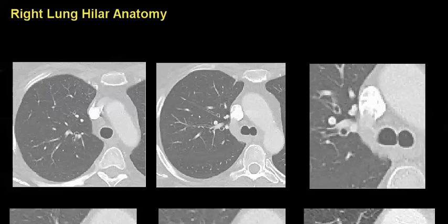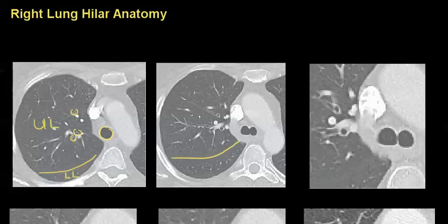Starting here, you can see right here is the trachea. Way up here we're in the right upper lobe, and you can see some of the apical bronchi here. Right about here you can see the fissure, and you can see it here as well. So what you have is the upper lobe, and just the tip of the lower lobe down here.